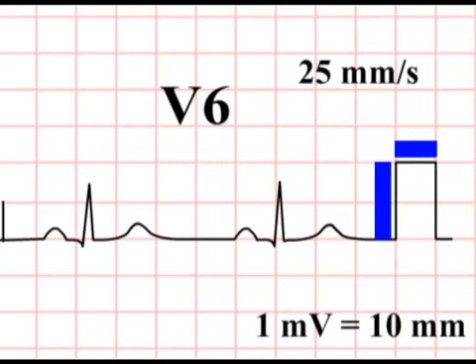As we've seen, knowing the speed at which the ECG recording needle is moving over the paper is critical, as it allows us to time the events of the cardiac cycle and to calculate the heart rate. Again, we'll see later that it is sometimes useful to alter the paper speed when analyzing cardiac arrhythmias.